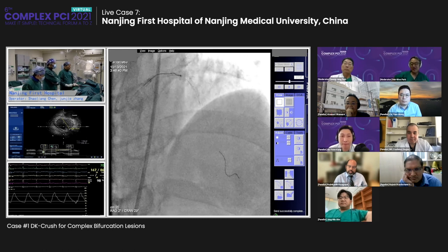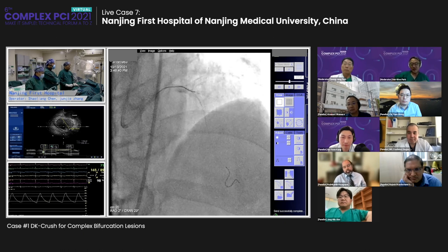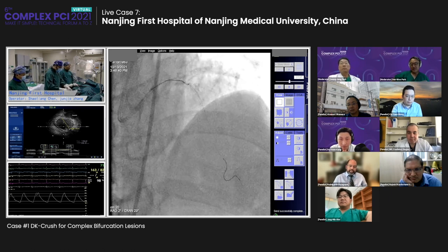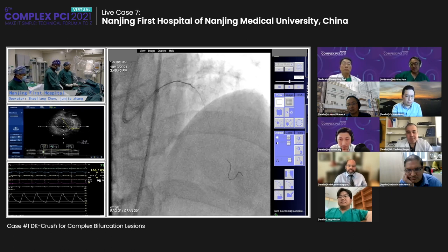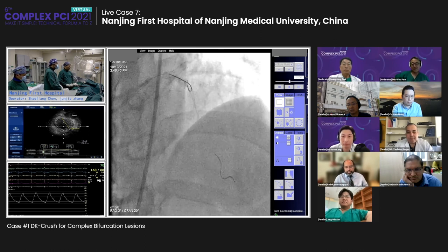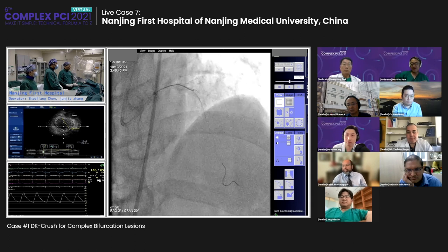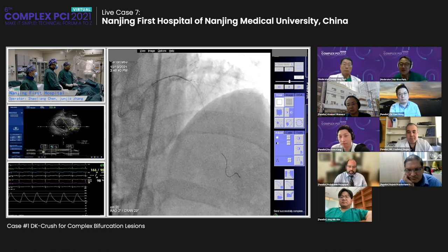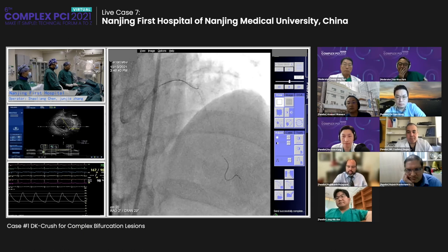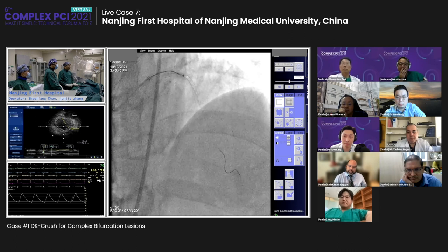The distal wire is a little bit damaged. Looks like damage. Right. I think there will be damage. I will change my technique. Okay, you can see I put the wire through the distal strut and quickly pull back. So the wire is toward the diagonal. The wire is very soft, I feel.